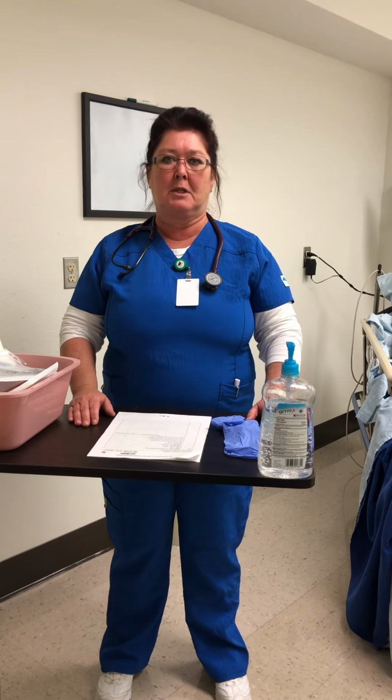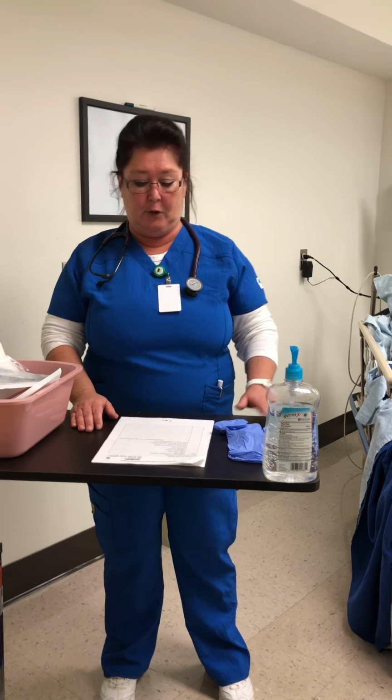Hi, my name is Tiffany and I'm going to be demonstrating insertion and removal of an NG tube as well as documentation of intake and outtake for fluids.